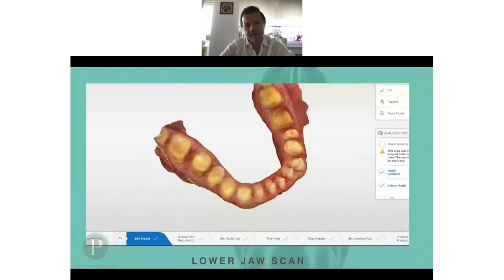You see the teeth in the lower jaw, teeth 4.3, 4.4, and 4.5. There are some veneers. It's very hard to say they're veneers; it's some combination of onlay and veneer.